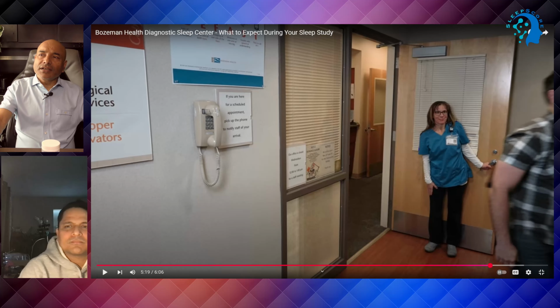Now this is the in-lab sleep study. The other thing is we discussed three kinds of sleep study. Standard NPSG 95810, and we discussed split night, half NPSG, half CPAP. And the CPAP titration. CPAP titration is complete when they come to the sleep lab and directly use the CPAP machine. Okay, let me show you.